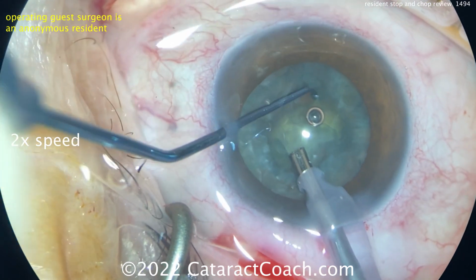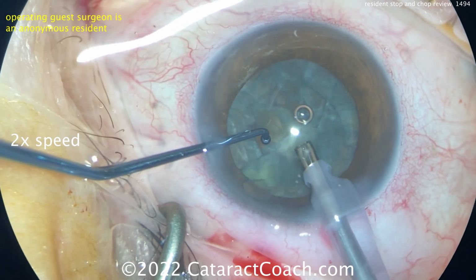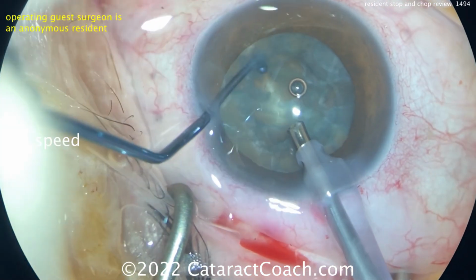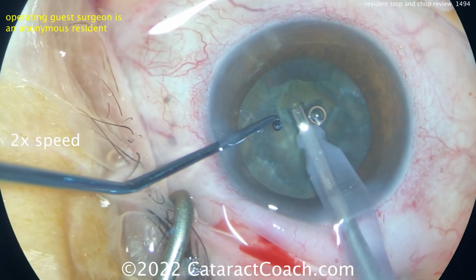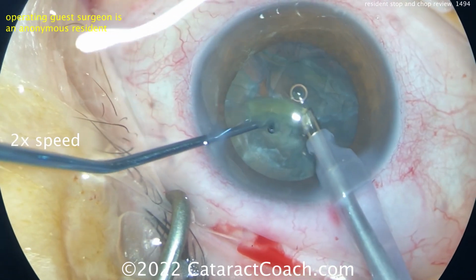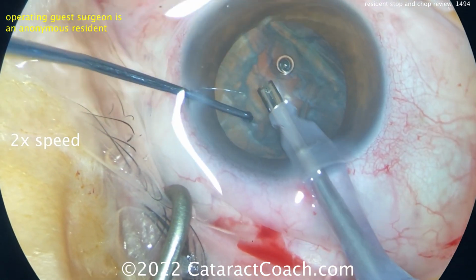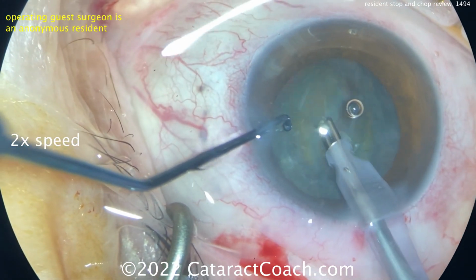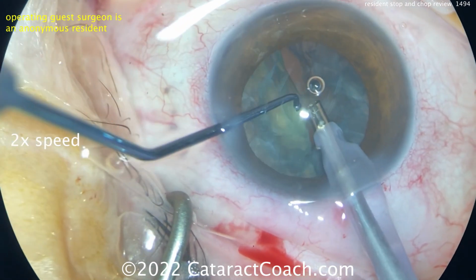Sometimes in these cases, if they're too soft, when you apply the vacuum holding power from the phaco probe, the piece will just kind of erode away and you'll lose that grip. So sometimes you just have to go behind the piece with the chopper and bring it up. And once you've created a little bit of room, now the other pieces can come up quite nicely. So in this one, you really don't have to do much chopping. Once you have the two grooves, each piece can be brought up and easily emulsified because this is a relatively soft cataract. So in a case like this, I think stop and chop is a very reasonable approach.